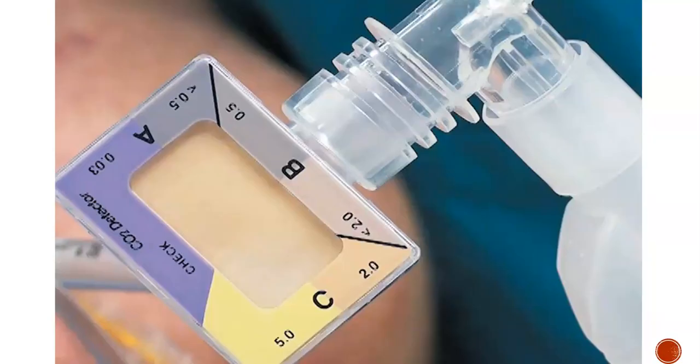So, for example, if a blood gas shows us that the PaCO2 is 40 millimeters of mercury, and then we look at the end-tidal CO2, and we see that it's 36 millimeters of mercury, then that gradient is +4, which is within that normal range of 2 to 5, right?